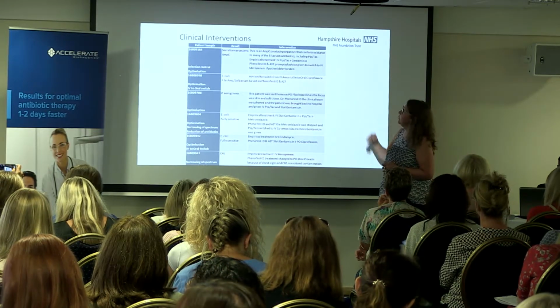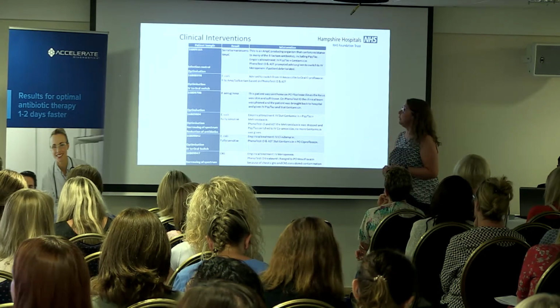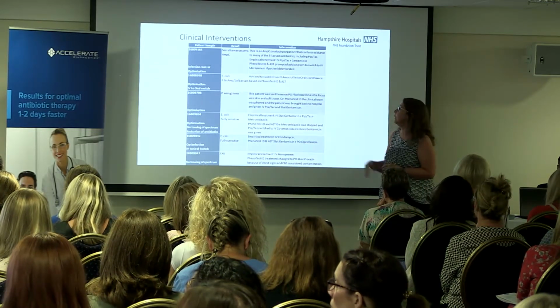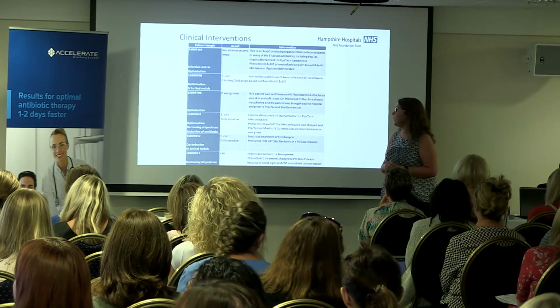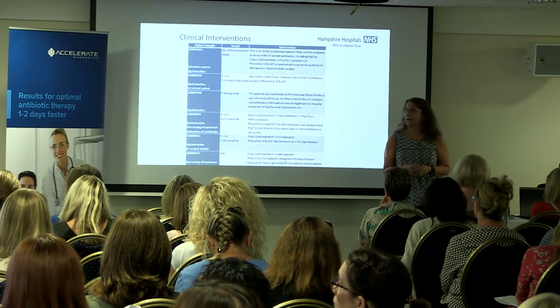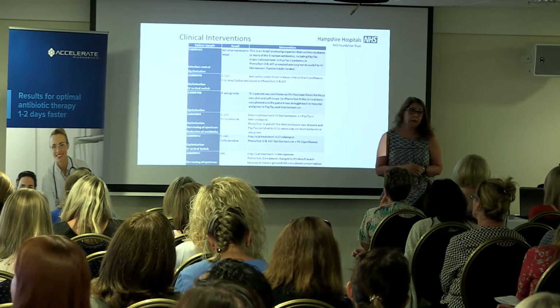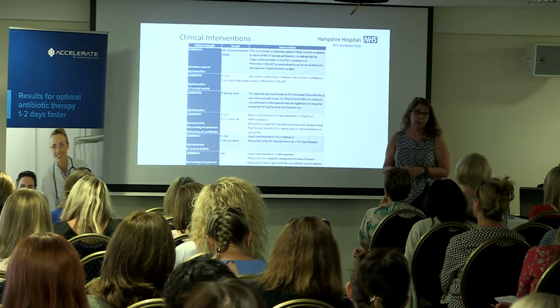The first one was a patient that we actually found an AmpC-producing Serratia in. The patient was currently on Tazocin and gentamicin. So given the fact that Tazocin won't be effective, we switched them to meropenem. And we had a patient who was seen in ED and sent home just on oral flucloxacillin because they thought that they had a Staph aureus skin infection, but the blood culture came up positive, and by the time we'd called the team, we knew it was a Pseudomonas, so when they came back in, they were reassessed and started on anti-Pseudomonal treatment.